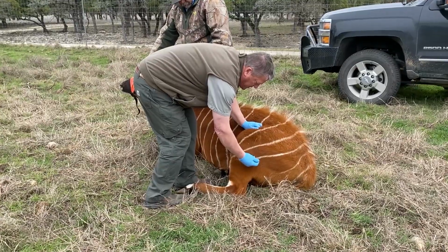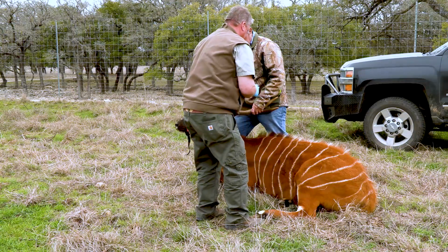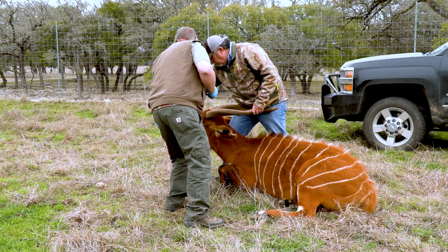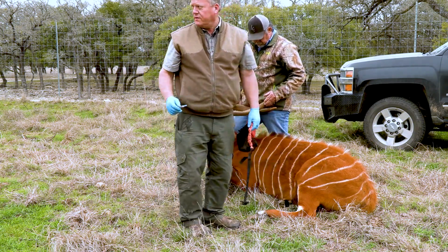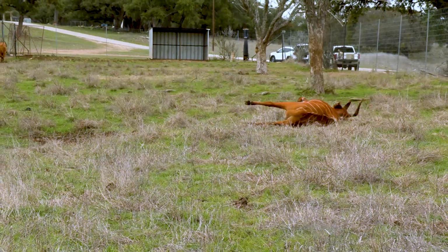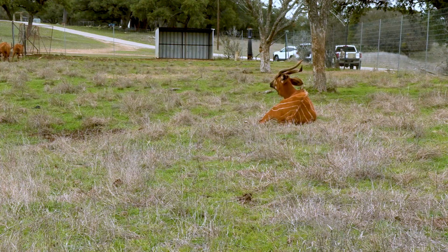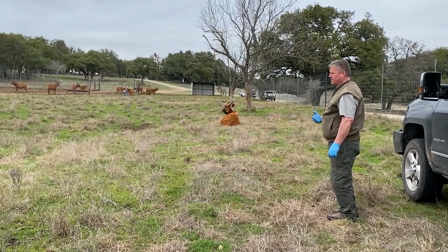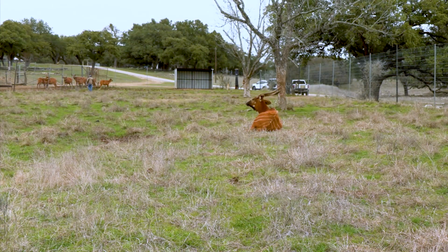The dart has been confirmed out, and that's always important. We'll take our mask off, and then we're going to get a safe distance away from her and watch her as she recovers. She'll stand up many times in the first few seconds. She may even come walking back to us because she's still under the influence of that drug. Not uncommon.